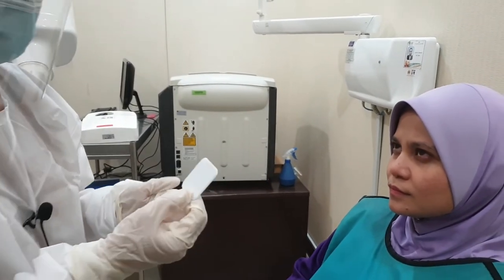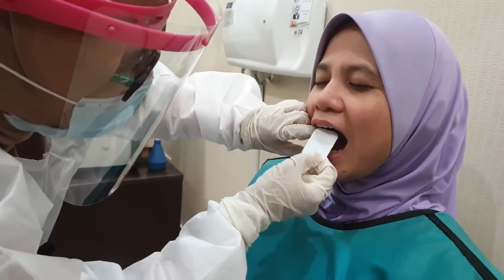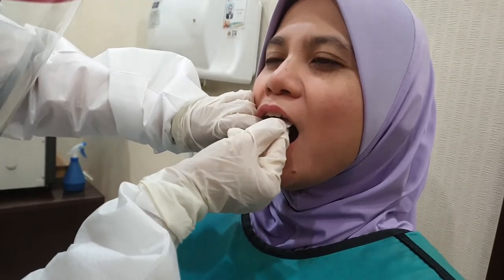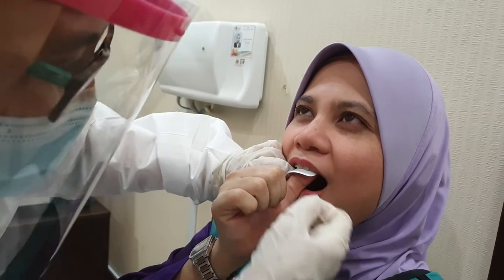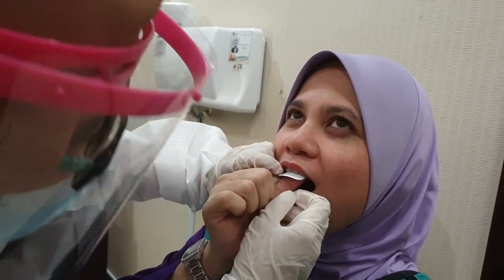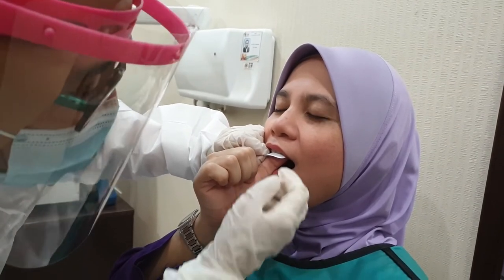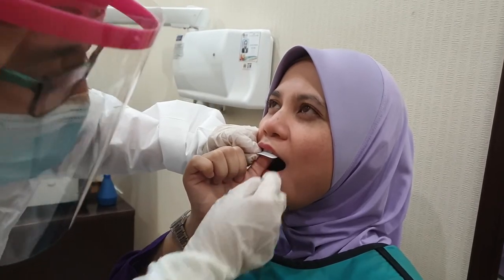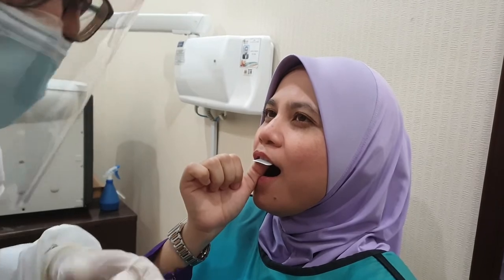Ask the patient to hold the film for you. Place the film first, and that is the best position the patient can hold the X-ray film. You might want to advise your patient to hold it slightly away from the tooth that you want to see, because you don't want the thumb to interfere with the tooth you want to see on the X-ray film.